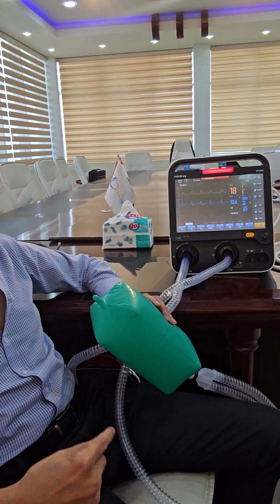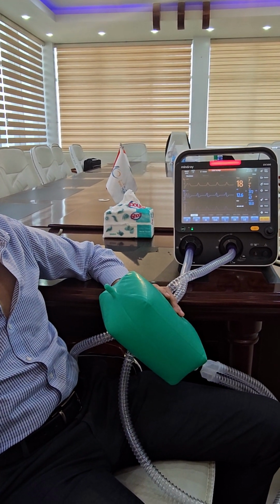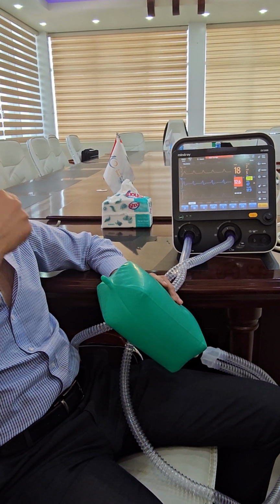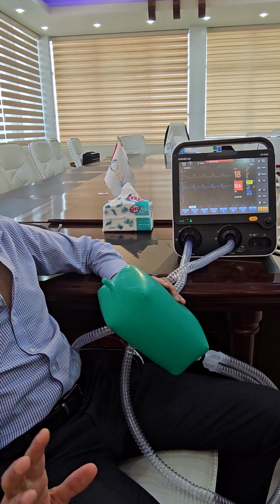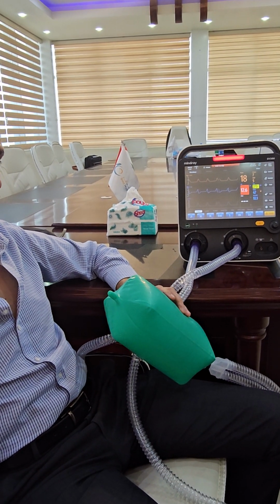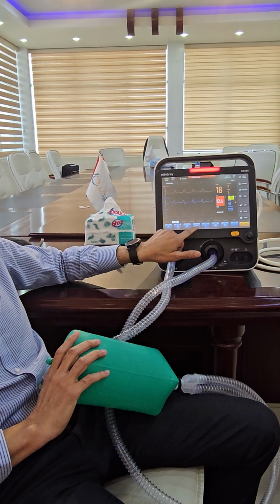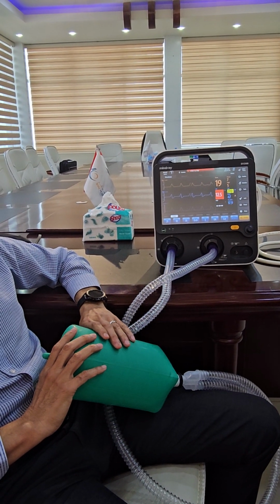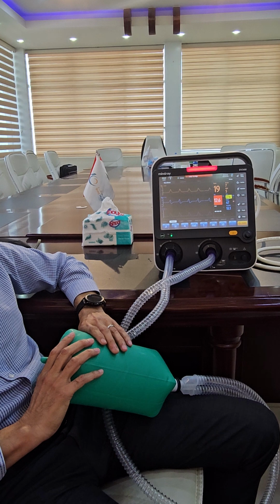Clear? If the patient breathes 20, the rate is still 35, because 35 is the lowest, and anything above it the machine will help with. If not clear, I will explain again. What is the rate here? 35. The machine will never give below 35. If the patient breathes 40, it adds 5.